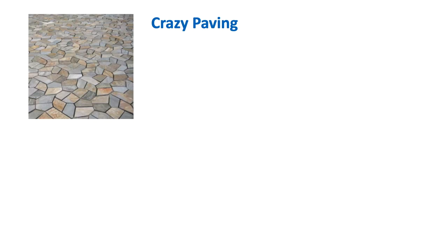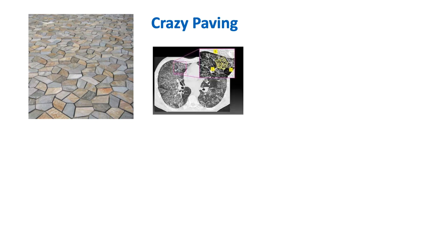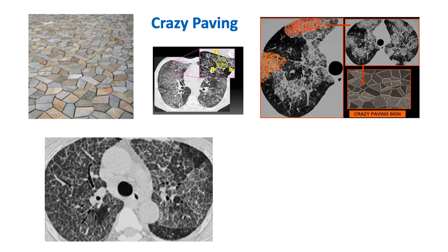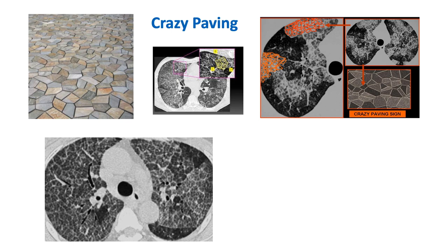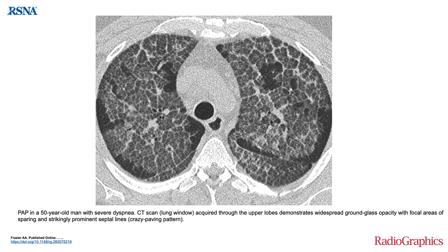Another finding: crazy paving pattern. It looks like irregular tiles on a footpath put together. In CT we see similar findings — superimposed interlobular septal thickening on ground glass opacities. One image shows air bronchogram within ground glass opacity lesions — the dense white is consolidation and the slightly hazy part is ground glass opacity. Another patient shows multilobe infiltrates with widespread ground glass opacities, focal areas of sparing, and prominent septal lines — this is the crazy paving pattern.